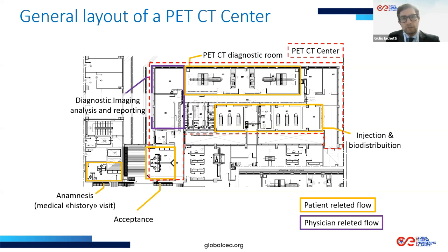The physician, in general, is obviously always in the hot area, just to check and control the right protocol, but there is always an area placed in a cold area for diagnostic imaging analysis and for reporting.